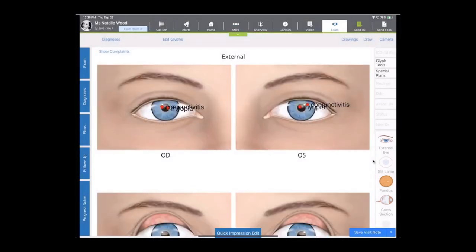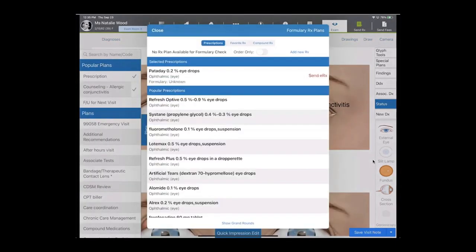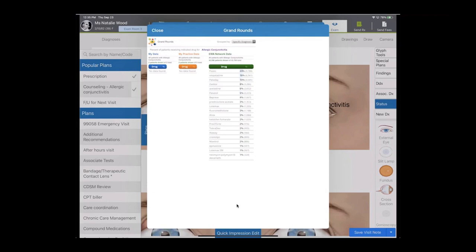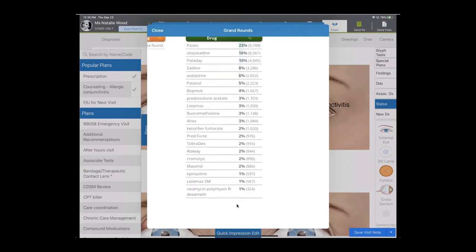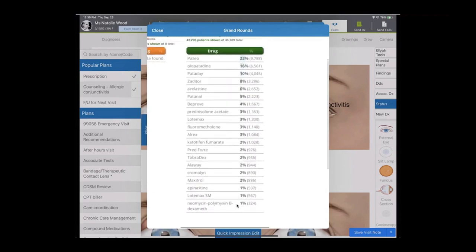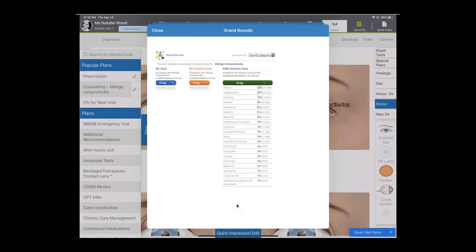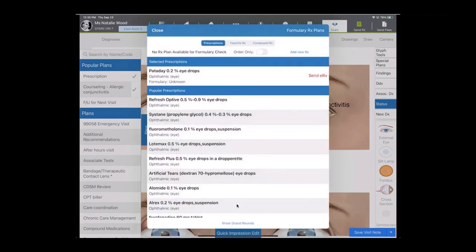Like I may want to resume this prescription and take a look at this again. So we've got Pataday as the selected prescription, but if I wanted to see what else was available to ePrescribe or maybe other folks in our network, what they're prescribing, I can click on this Grand Rounds and get some industry data on other options that are available to be ordered. And then ePrescribe right here in the system.